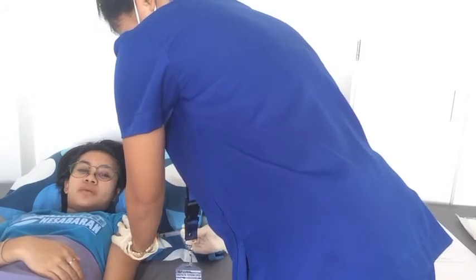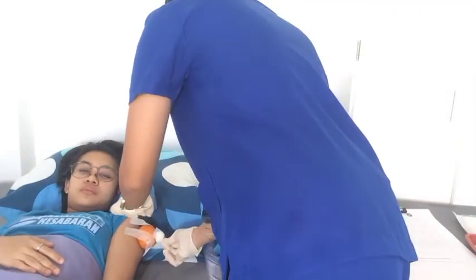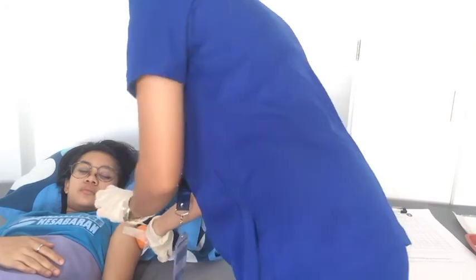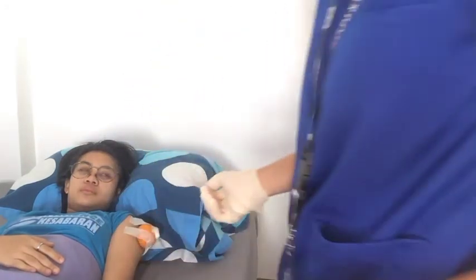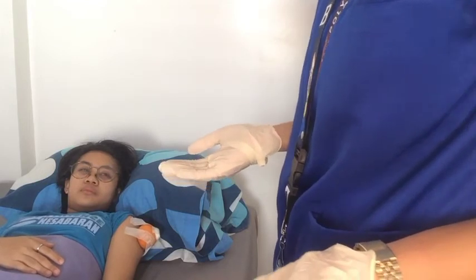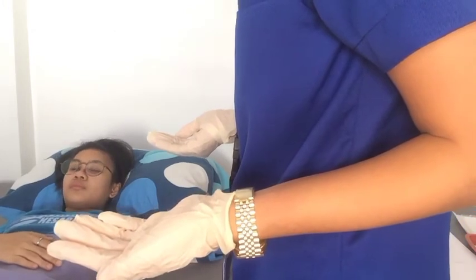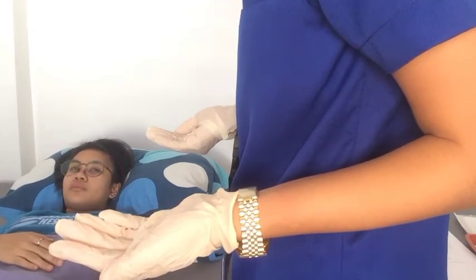If blood appears in the syringe, withdraw the needle, discard the syringe, and prepare a new injection. If blood does not appear, inject the medication steadily and slowly, approximately 10 seconds per milliliter while holding the syringe steady. After injection, wait 10 seconds. And then withdraw the needle smoothly at the same angle of insertion. Release the skin, apply gentle pressure at the site with a dry sponge. If bleeding occurs, apply pressure with a dry, sterile gauze until it stops. Activate the needle device or discard the uncapped needle and attached syringe into the proper receptacle.